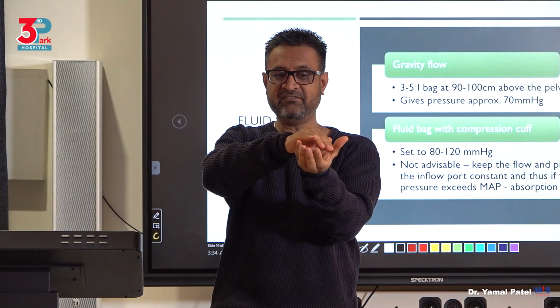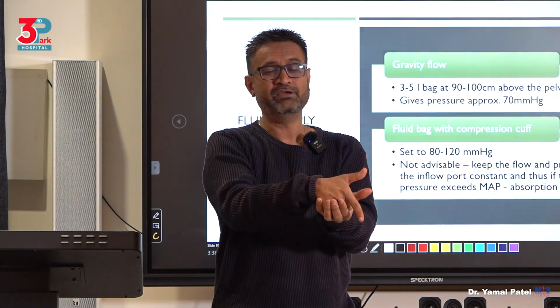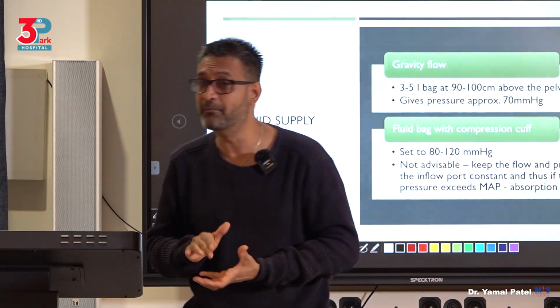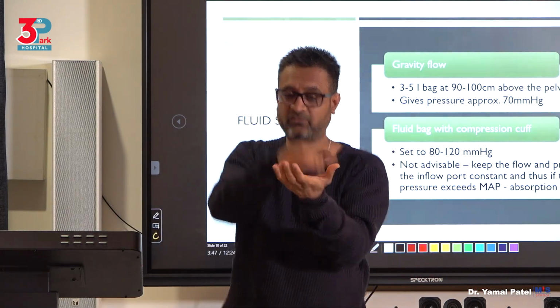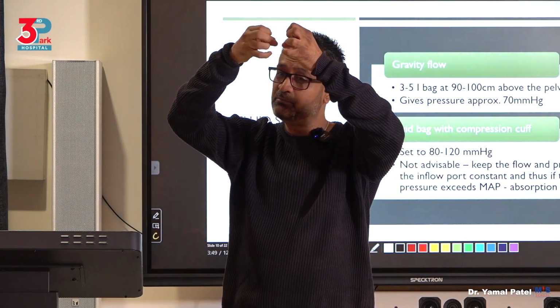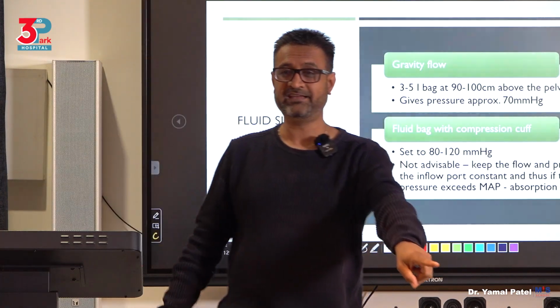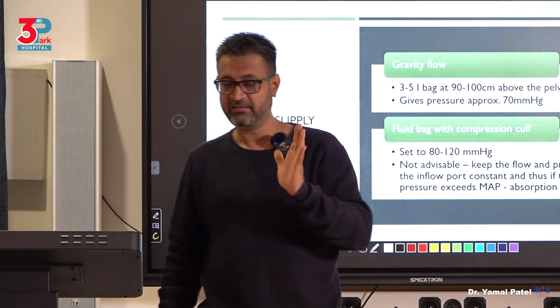Now, if this cavity is already distending and it's still distending, you are still pushing in whether the pressure inside there has reached or not. It is constantly still pumping in. And if you suck out or it's leaking and it's compressed, it's falling, this is still putting constant flow. It's not increasing the flow when the pressure down there has reduced. Are we understanding each other there, guys?